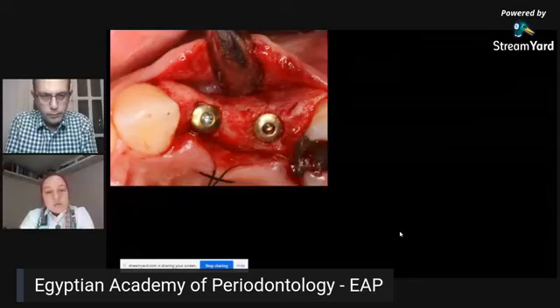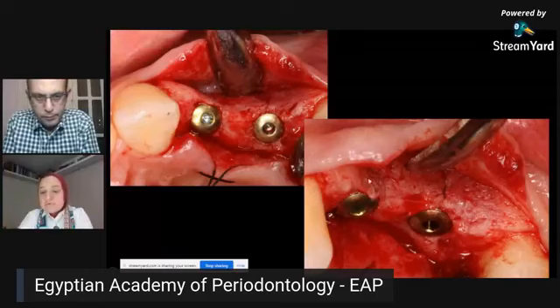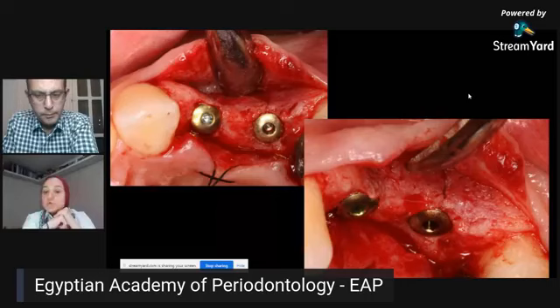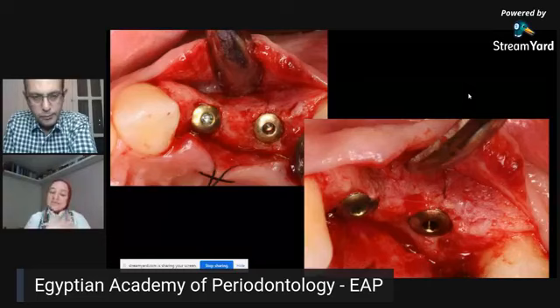So we placed the two premolars, the 4 and the 5. And as you can notice here, we have the crack that we expected to happen. And we have thin bone overlying this premolar. Let's think, what's thin? How much can you go? What's the minimum that you need buccal to an implant? What we know for sure right now from the evidence is that you need a minimum of 1.5 to 2 millimeters of buccal bone, or of bone buccal to your implant, in order to guarantee that this bone will stay, that there will be no necrosis and resorption in the future.